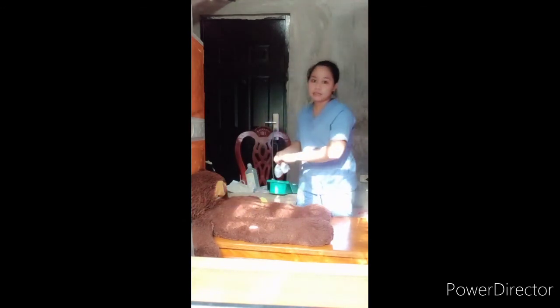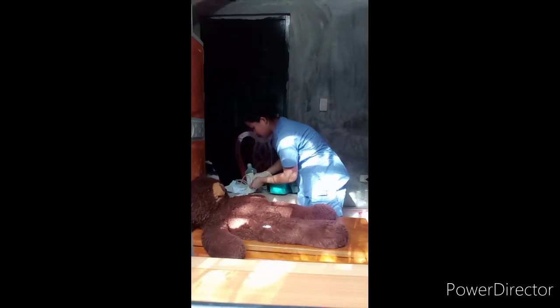And then next is let's remove the towel, place it in an appropriate receptacle, and position the patient. And let's apply clean gloves to continue personal care. Let's remove. And then next is position the patient and apply clean gloves.